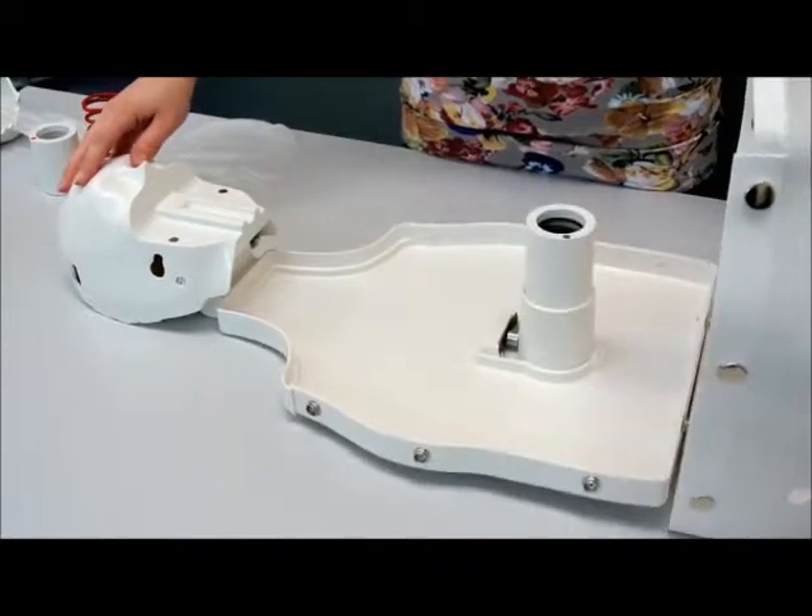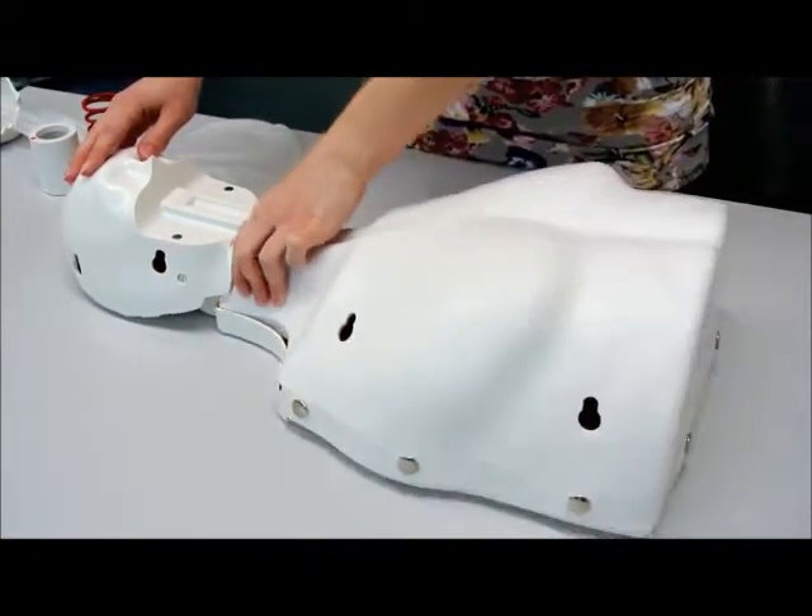Replace the cover, face skin, and thorax skin in reverse order.